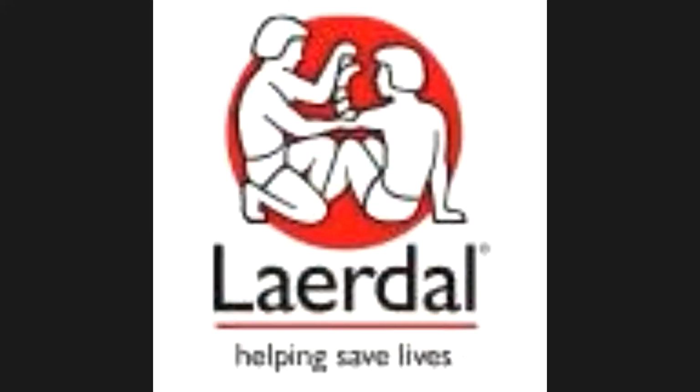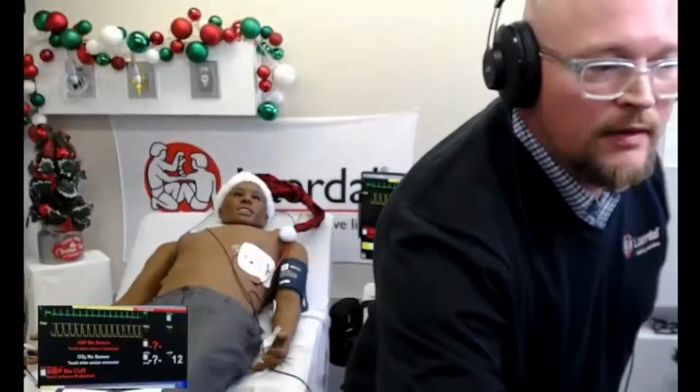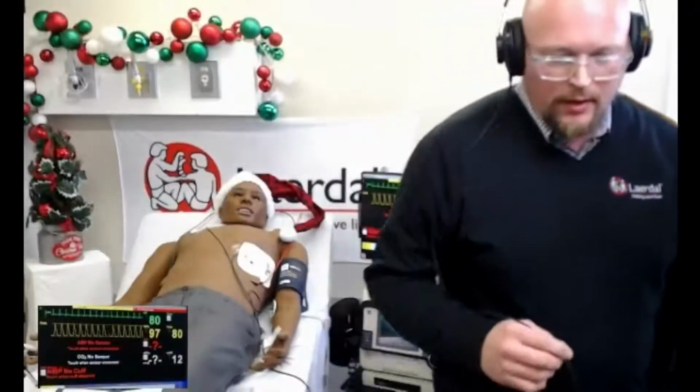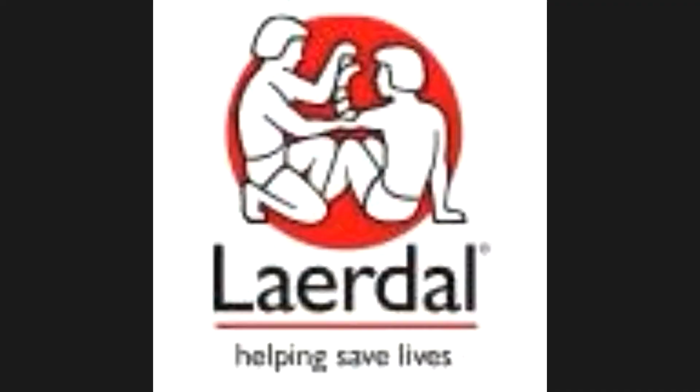Shane, do you mind if I ask you a question? Please do. So we had a question come in about anterior, posterior shocking. I know we're going to cover that towards the end in our hot topics for SimMan ALS and that new configuration. Do we have any tidbits on the 3G Plus in regards to anterior, posterior shocking?